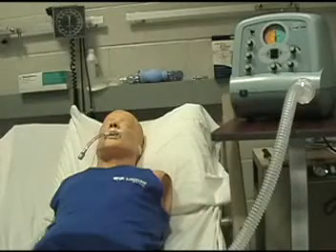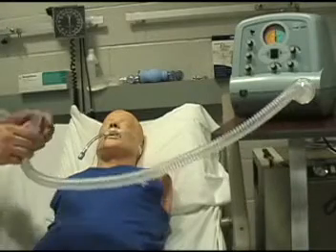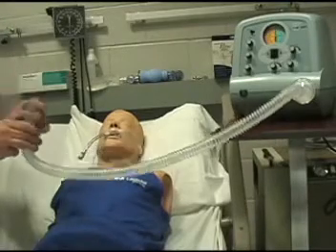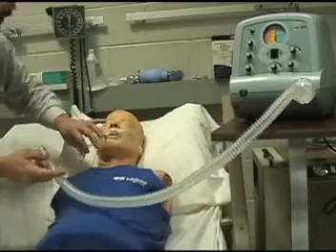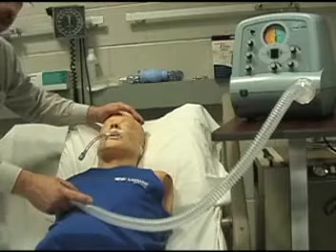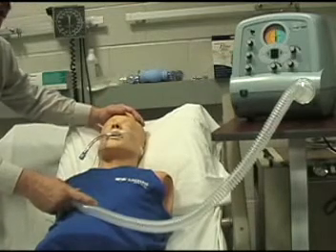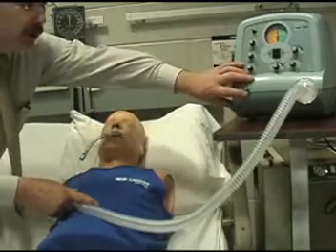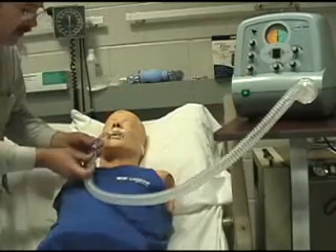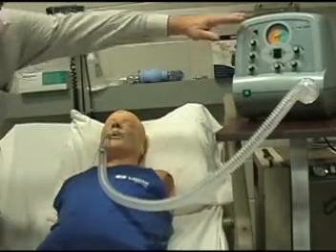Now I'm going to attach this to my mannequin. I have my endo tube adapter here. I'm going to tell the patient what's going to happen — it's going to push and pull the secretions out of the lungs. I'm going to turn it on, connect it, and it's in the auto mode now.